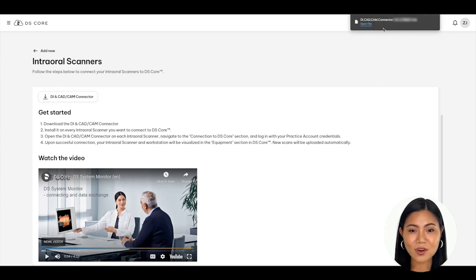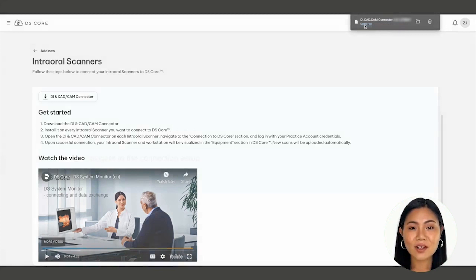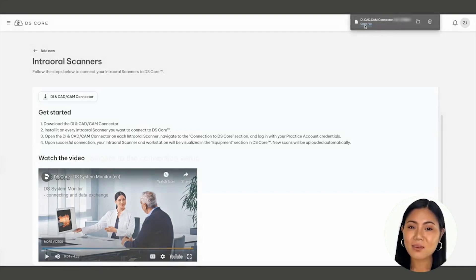Navigate to your download folder to open the downloaded connector file, log in with your username and password, and follow the remaining steps. Once you have completed the installation, repeat this process on any additional Dentsply Sirona intraoral scanners you have in your practice that are running CEREC Software 5.2.3 and/or Connect Software 5.2.3.